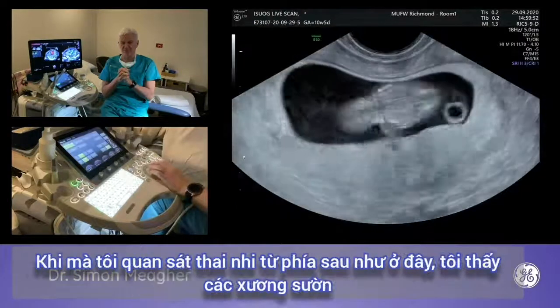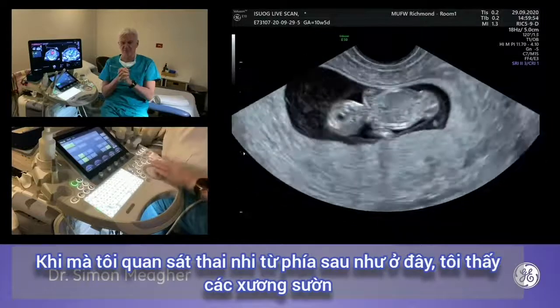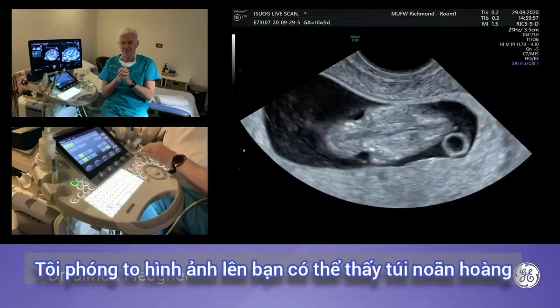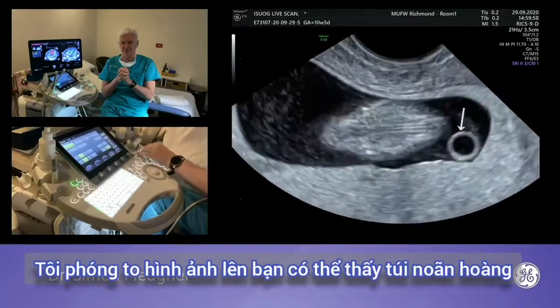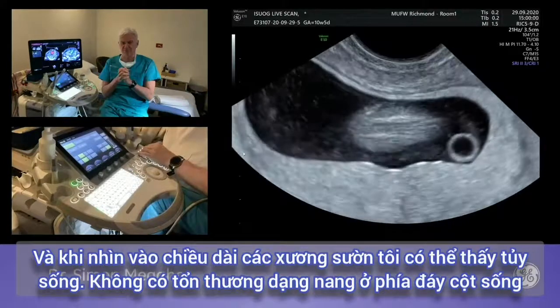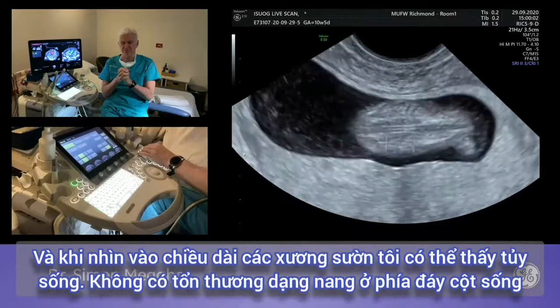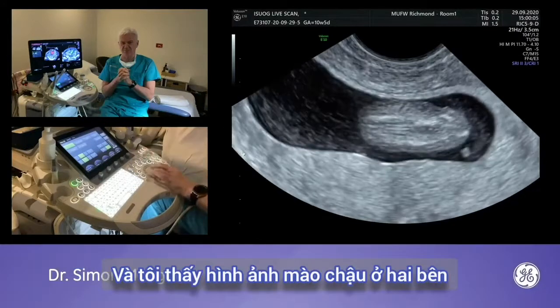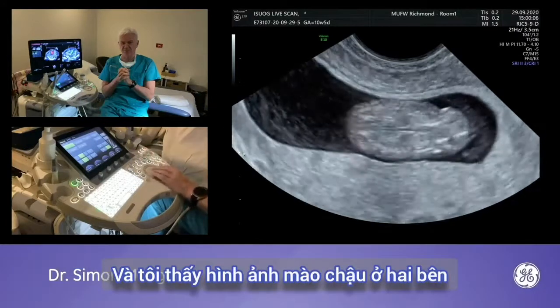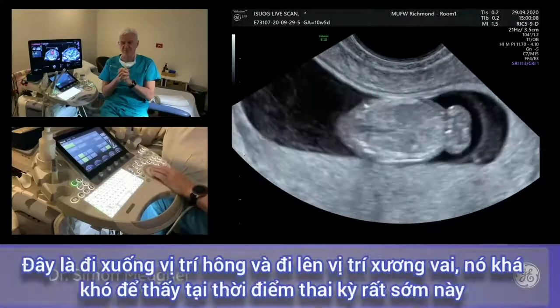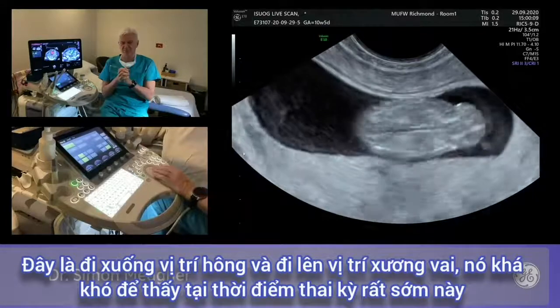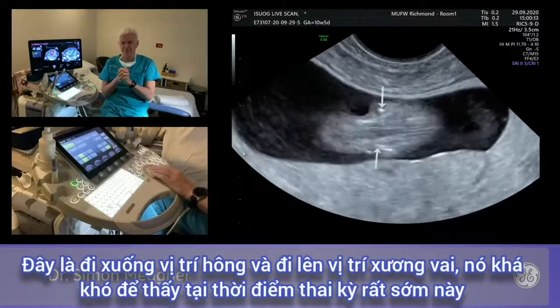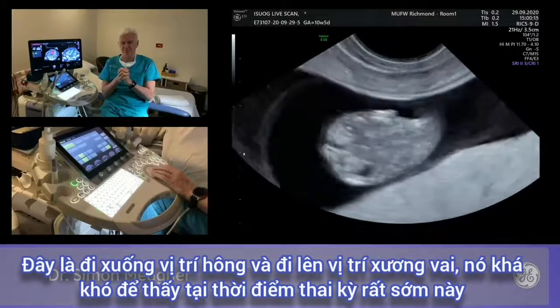Looking at the fetus through the back, I'm also looking at the ribs. Magnifying that image, the yolk sac is visible. Looking at the rib length, the spinal cord is seen with no cystic lesions at the base of the spine. Traversing down: the iliac crest on each side, down onto the hips, then up to the scapula — quite hard to see at this very early stage in gestation.